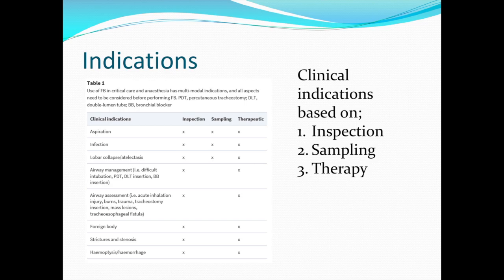Aspiration of gastric contents is often underdiagnosed in critical care patients, and it accounts for significant pulmonary dysfunction. Usually, the aspirated material is liquid and disperses rapidly, and so routine bronchoscopy with lavage is unlikely to prove useful. In the event that the aspirate is predominantly particulate in nature with clear radiographic evidence of lobar collapse or major atelectasis, a therapeutic bronchoscopy may prove useful.